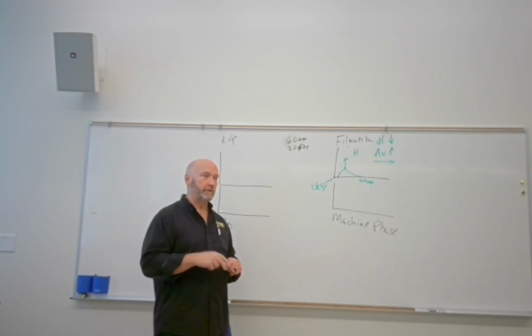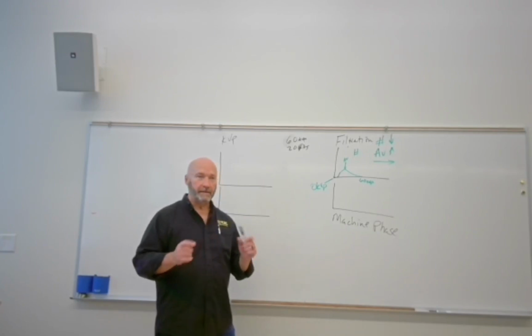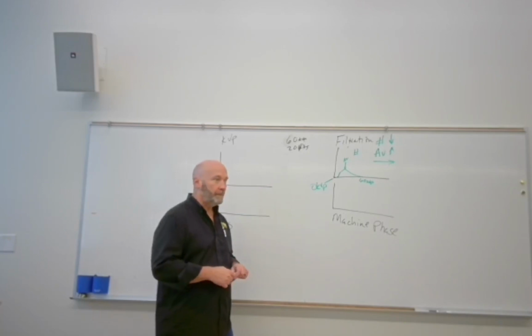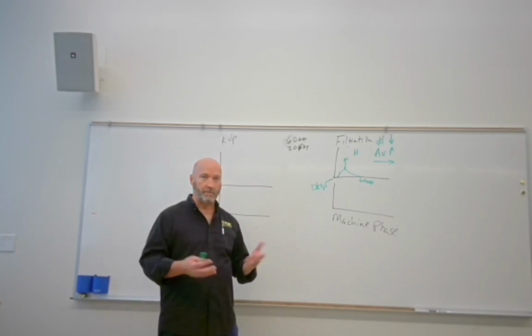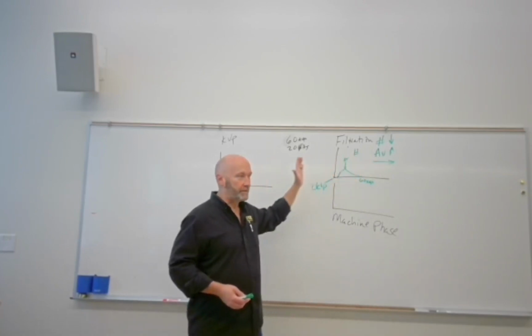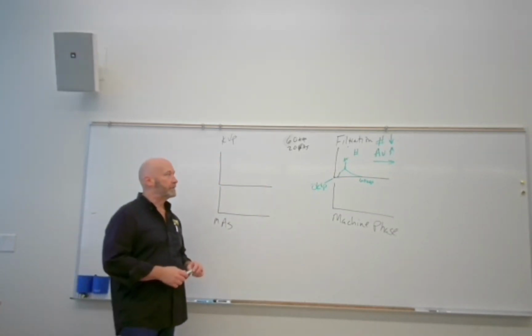By the end of that 2 years, you couldn't see kidney stones for anything. They added software and tweaked it and adjusted all the stuff that they could adjust, trying to bring up the contrast, and you couldn't see it. The only thing I can think of is that, because we used this thing so much, we lost contrast because of added inherent filtration in our X-ray beam. Nothing else on the system had changed except for how much we used it.